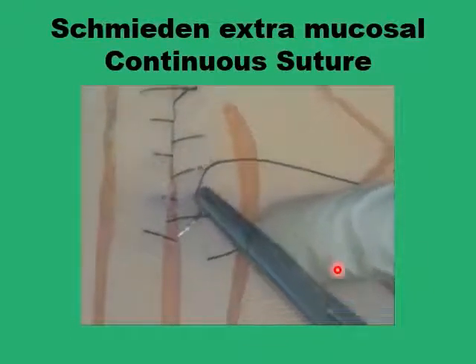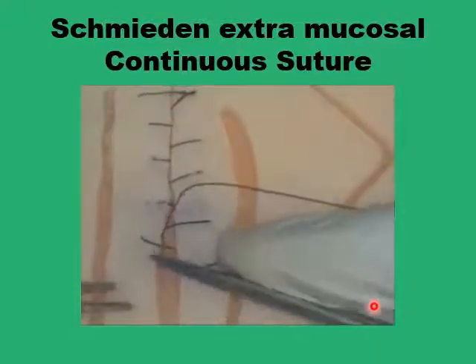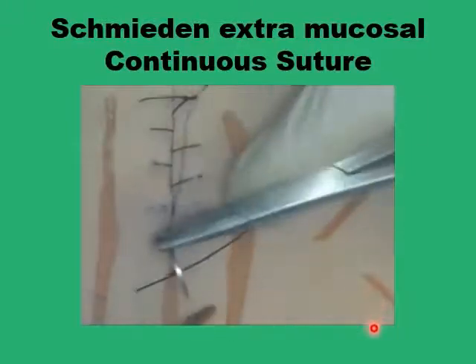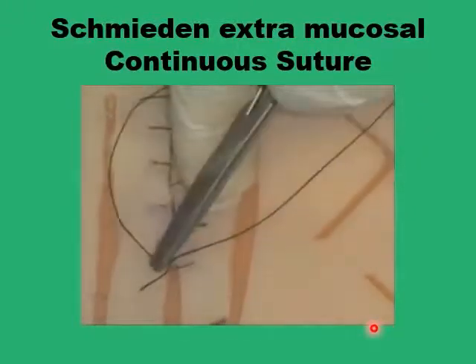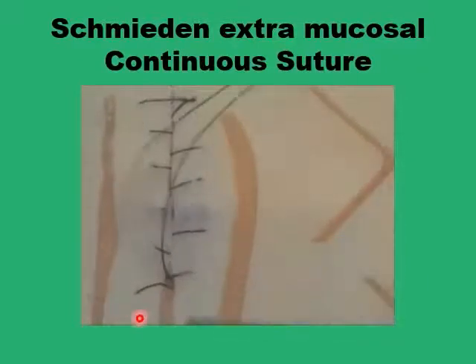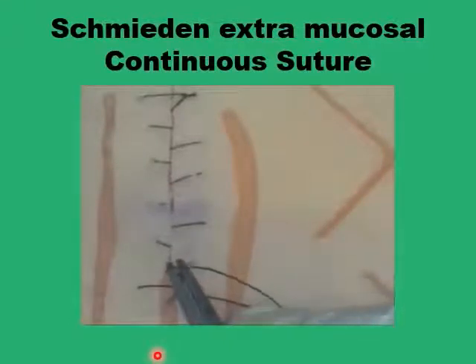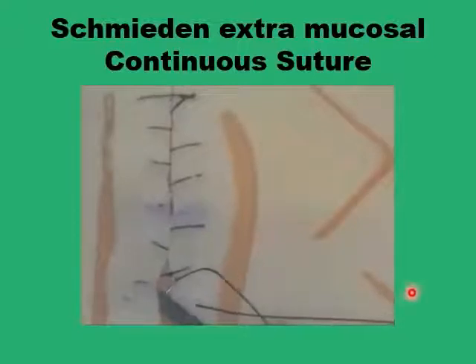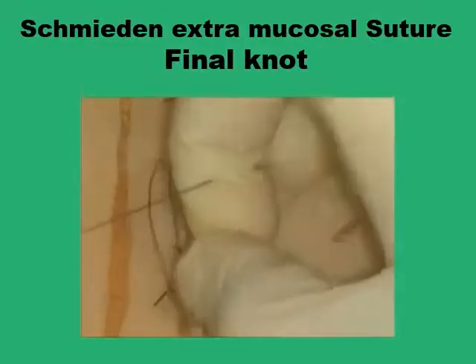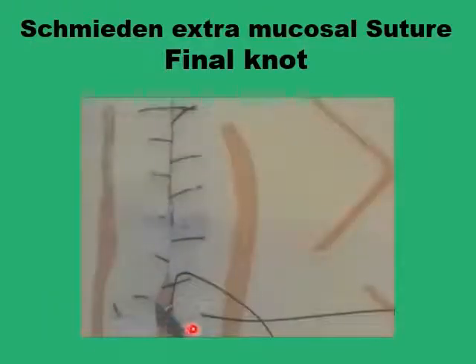Now that you have approached the end of the incision, you would start to consider finalizing the suture line. You again do the usual extramucosal bite and come out of the serosa. Now cross to the other side at the same level rather than moving diagonally, retrieve the needle. You have a loop on one side and a single strand on the other, and you can end with an Aberdeen knot, or you can tie a knot between the single strand and the loop to secure the final knot and finalize the suture line.